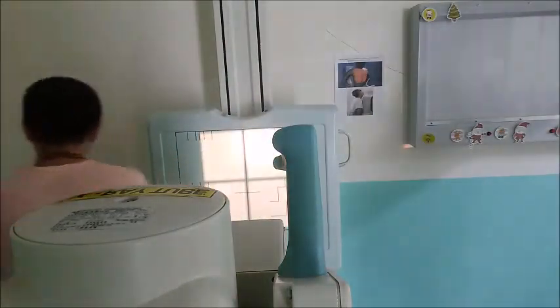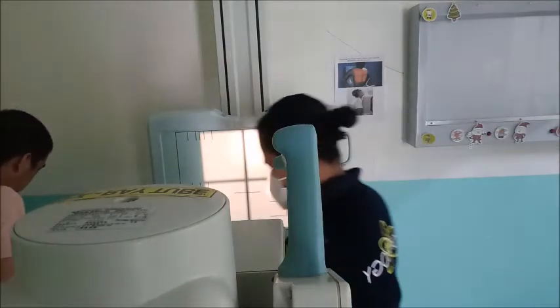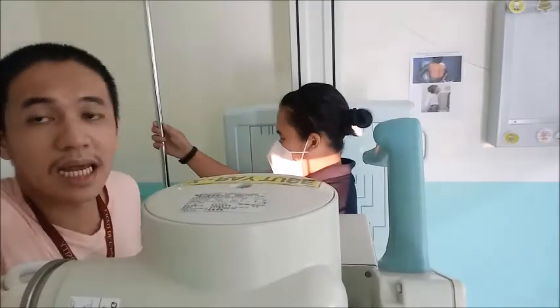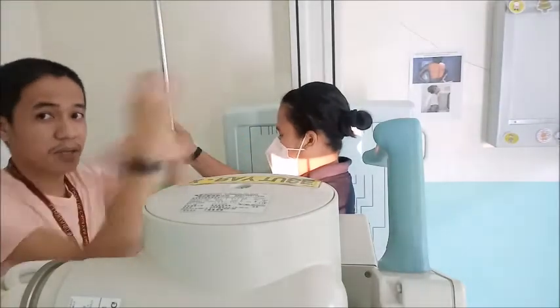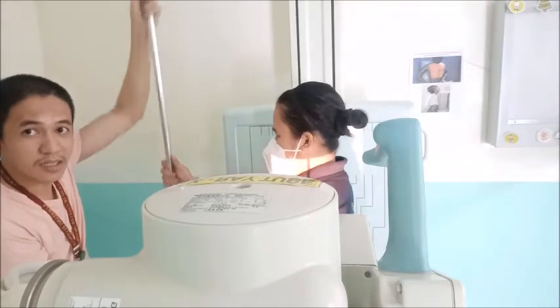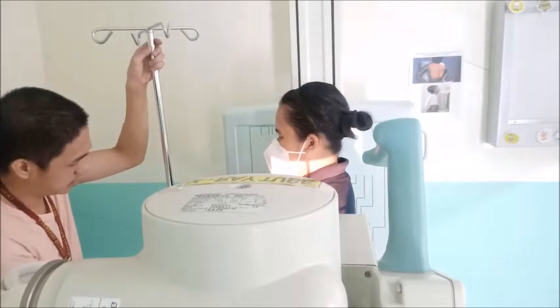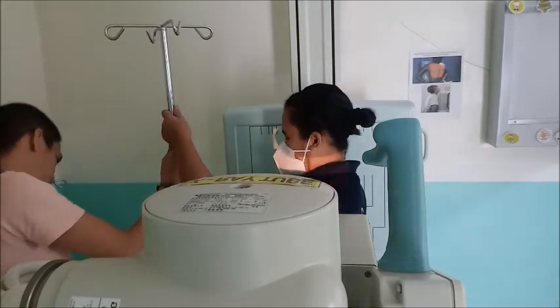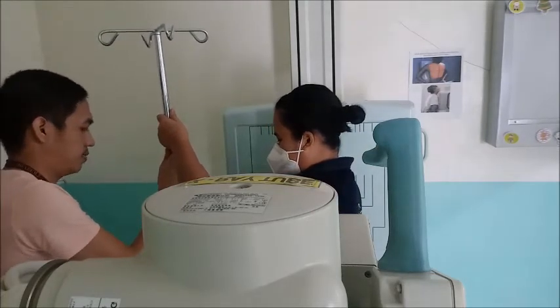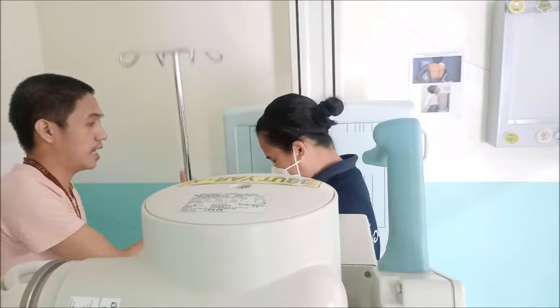Okay. So for some patients nga dili nila ma-raise ang ilang kamot, maglisod sila, may problem sa ilang shoulder, pwede nila gamiton itong mga dextrose stand, mga IV stand.